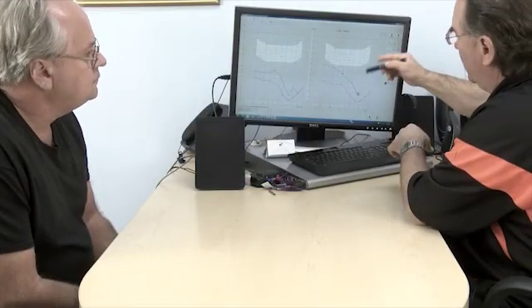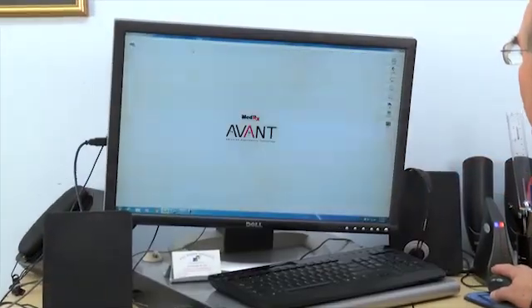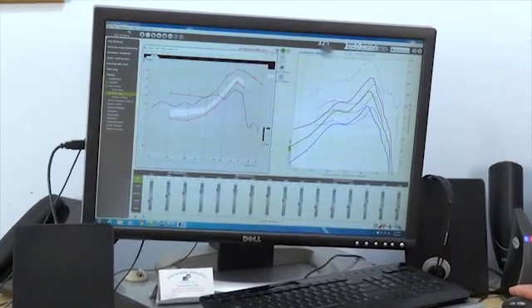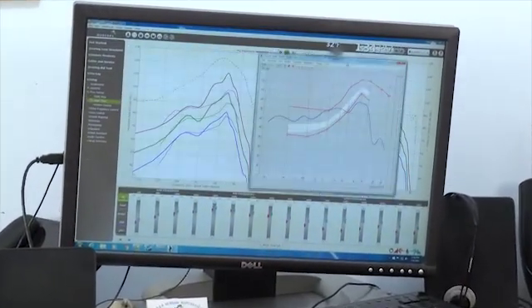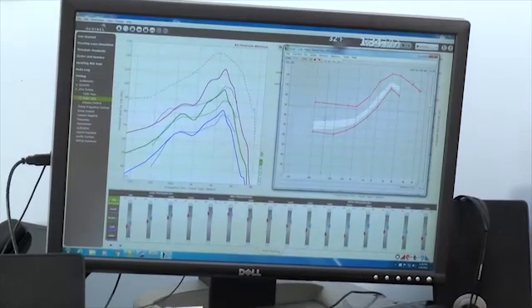What I want to do is remember the graph, Tim, that I showed you of your hearing loss. Well, what I'm going to do is go back and pull the graph up. There you are. We're going to set this over for your right ear.